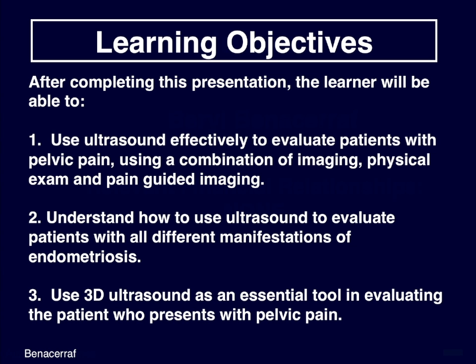The learning objectives are noted here, and we are going to learn how to use ultrasound effectively to evaluate patients with pelvic pain using a combination of imaging, physical exam, and pain-guided imaging ultrasound. We're going to understand how to use ultrasound to evaluate these patients because we're going to learn about all the manifestations of endometriosis, which is a big reason why patients have pelvic pain. And we're also going to learn how to use 3D ultrasound as an essential tool in evaluating patients with pelvic pain.